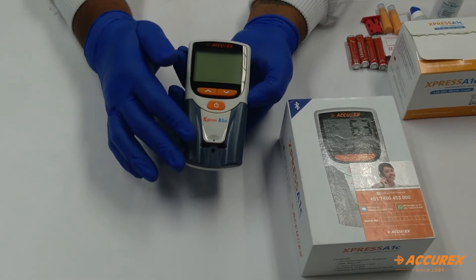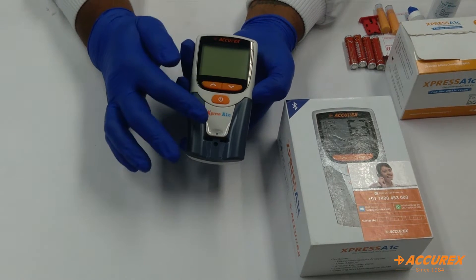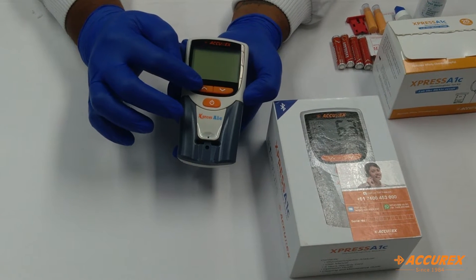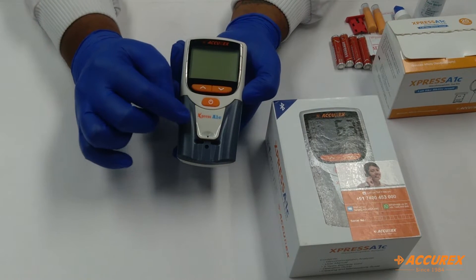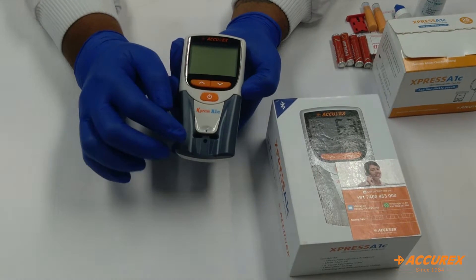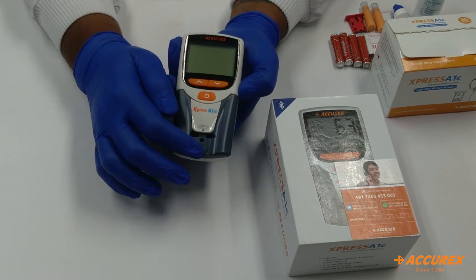Now we will see the Express A1C device and its features. This is the display where you find the reading. This is the upper button, this is the lower button, and this is the power button. There are two panels — the white one and the gray one. In the white panel, you can see the port used for the sample and buffer, and below that there is a strip injection port.